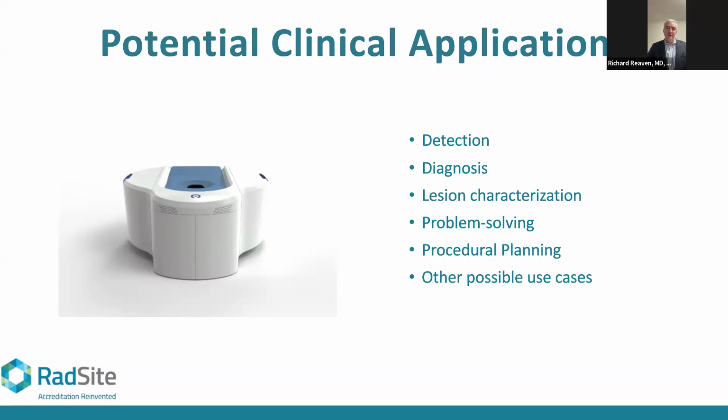And those that do, what happens is they come in for their mammogram, the technologist will do the regular views, and then they'll do what's called the implant displaced view, where they literally push the implant back and do a second set of images. So instead of the traditional 4 images for a regular mammogram, they're now getting 8 images altogether, which is more discomfort, more radiation, more compression, more manipulation of the breast. And so a lot of them are avoiding mammography altogether as a result.